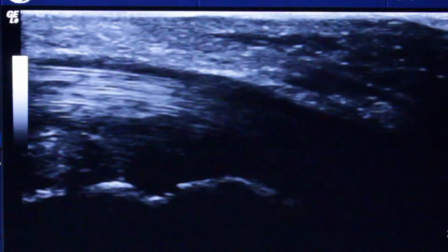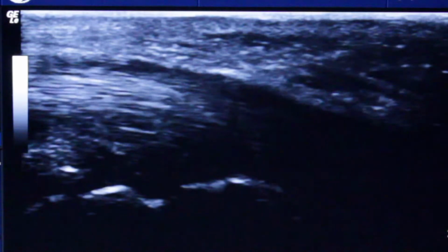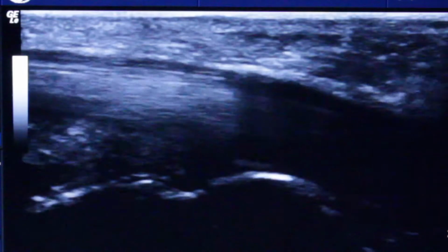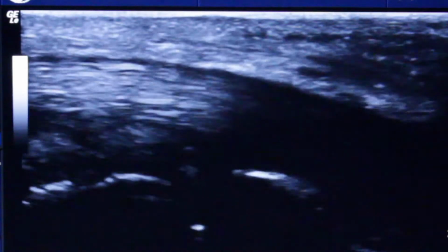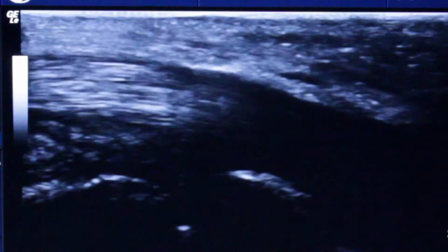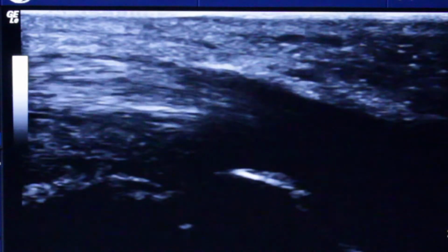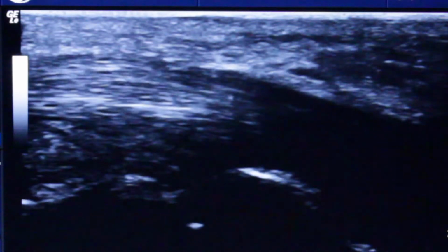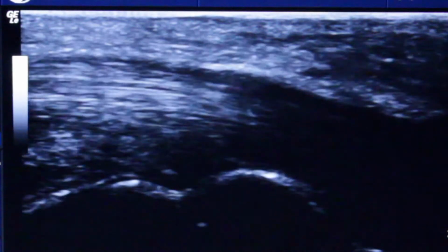I'm going to tilt away again with the neck, depress the shoulder, try to extend my arm or my shoulder as much as I can while still keeping the transducer on. I'm going to release my fingers, so now I'm going into that fist again. I'm going to extend my fingers. Notice the nerve is holding place. They're moving relatively amongst each other. Now here's the nice part. Let's keep that view of the interface between the two, and I'm going to tilt back with the head, with the shoulder, and see how the nerve just kind of nicely moves towards the right of the screen.